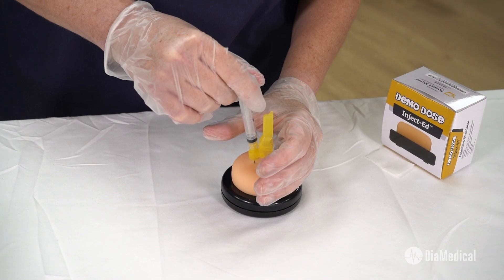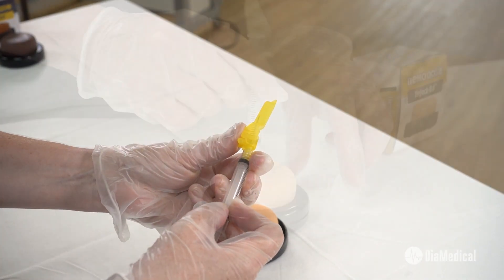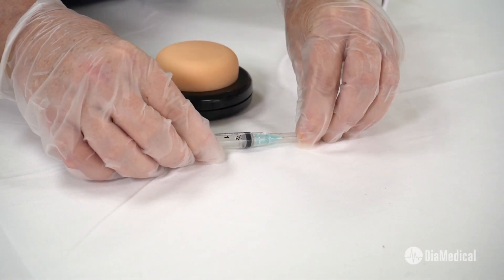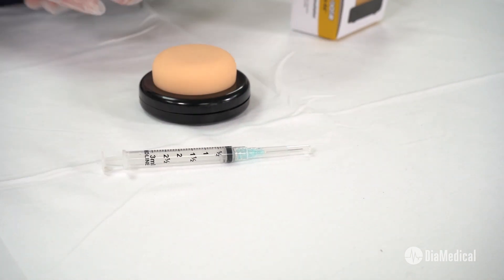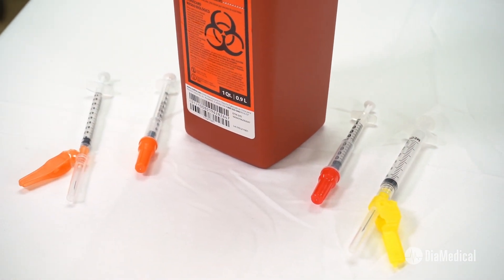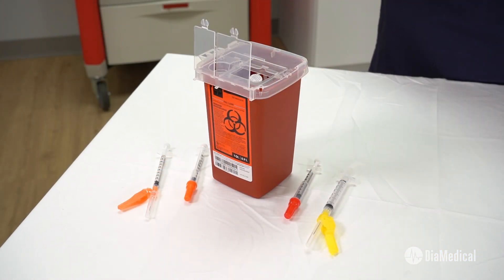Of course, the injection pad is only half of the skill. Recapping needles during practice in the Sim Lab sets the stage for students to do the same with real patients, putting them at high risk for needle stick injuries. Cost-effective syringes with safety needles enable students to engage the safety mechanism every single time.